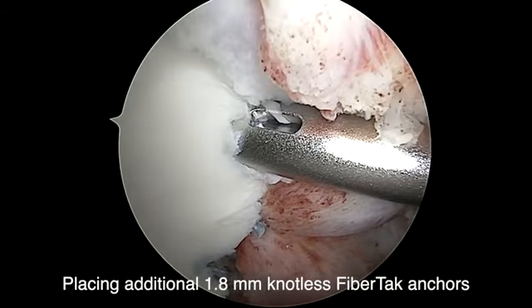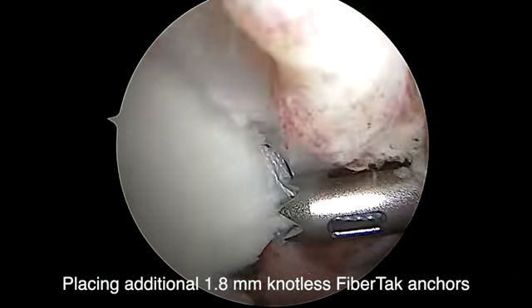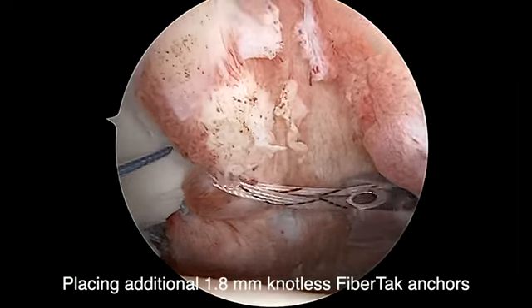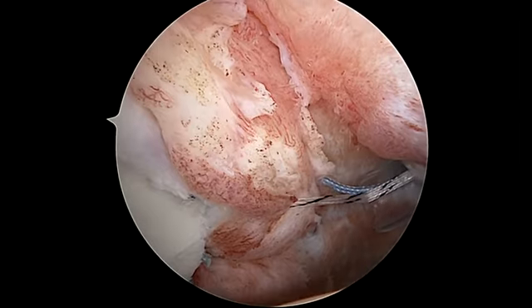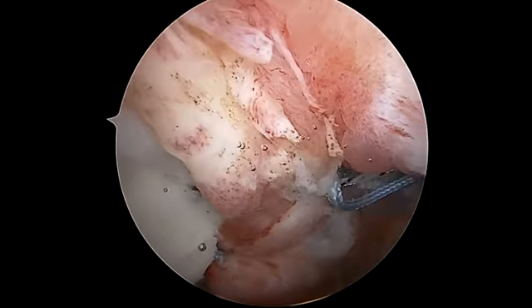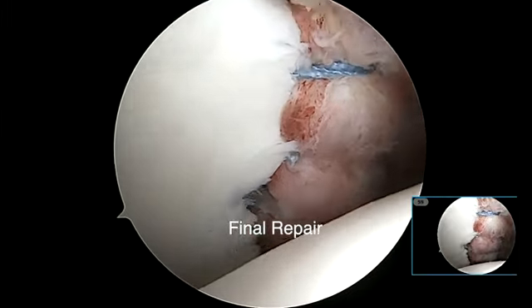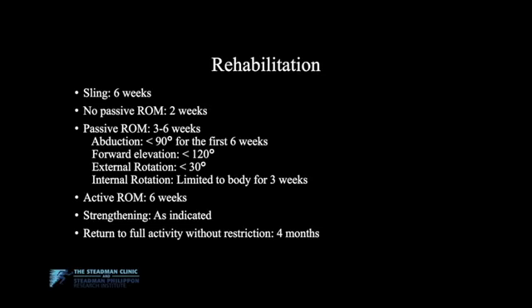In this case, two additional superior 1.8 mm knotless fiber tack anchors are placed to reinforce the posterior superior capsulolabral tissue. Additional anchors may be placed as needed, depending upon the injury pattern. The repair construct is then evaluated and the shoulder is dynamically assessed under direct visualization, demonstrating restoration of posterior stability to the glenohumeral joint. Our rehabilitation protocol is initiated directly post-operatively.